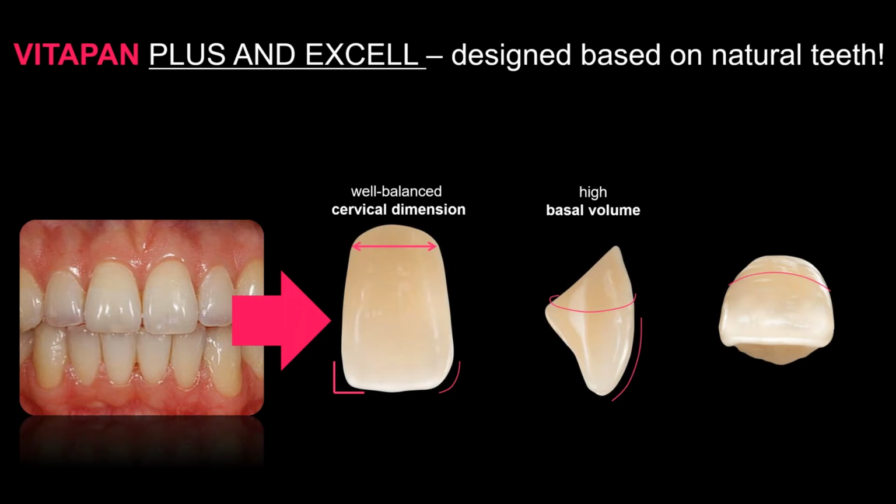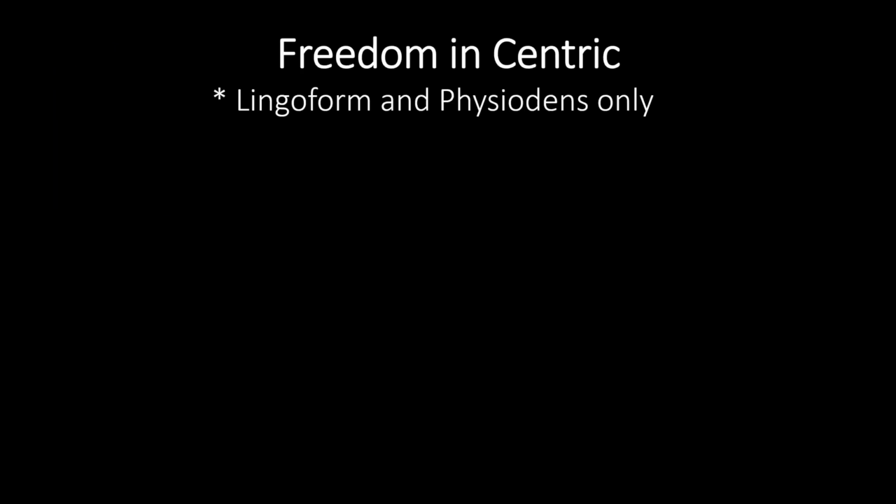So again, everything is golden proportioned, so the dimensions of the teeth are all golden proportioned against each other by math. I hate to say it, but I should have paid more attention in math class in high school. But here we are, everything's math, and I'm learning to appreciate the golden proportion rules now in denture design. So we have to always ask ourselves, what does the patient want? And then, of course, should we change it?